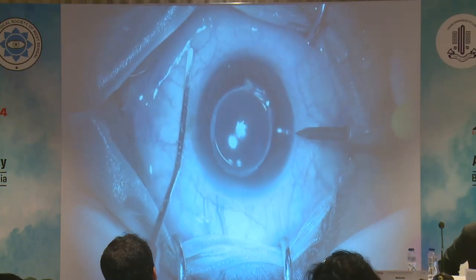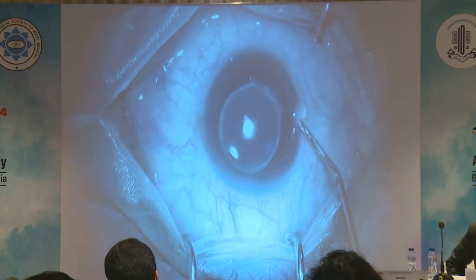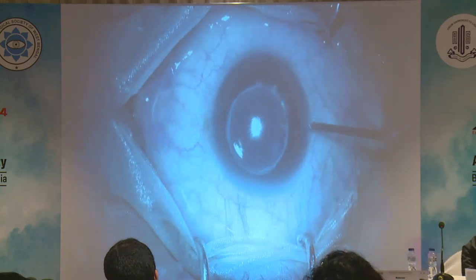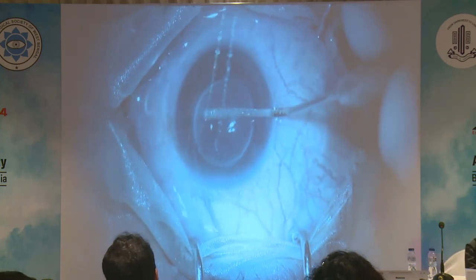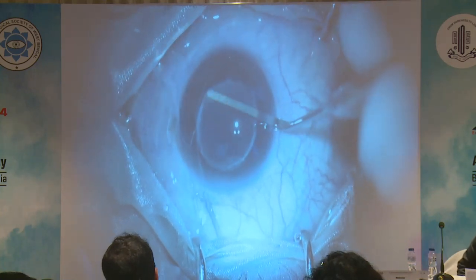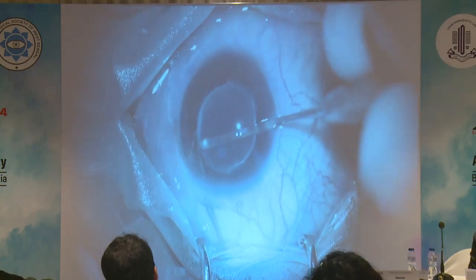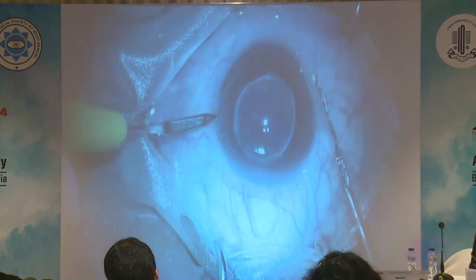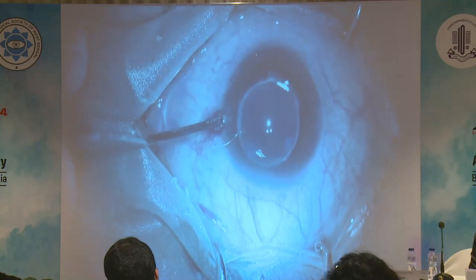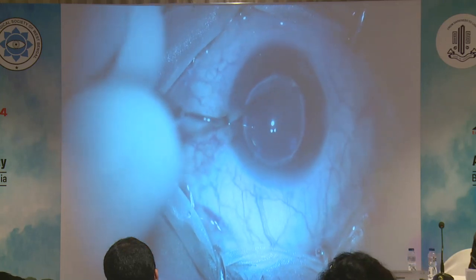I made the temporal side port, inject viscoelastic and take a cyclodialysis spatula to swipe it underneath the anterior capsular margin so as to separate the capsular rim from the IOL optic edge. I make the nasal side port and repeat the swiping action with the spatula underneath the capsular margin.